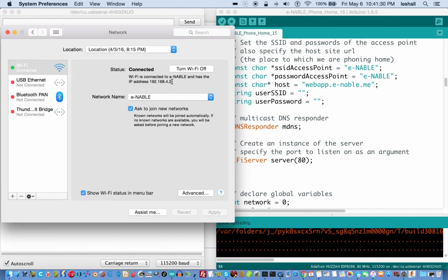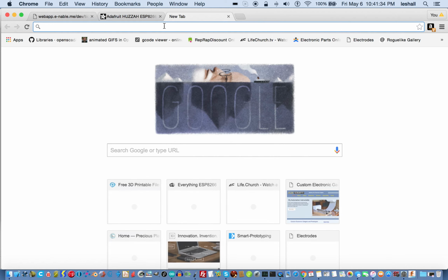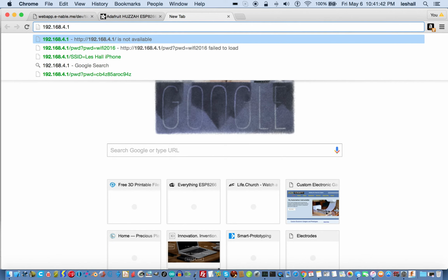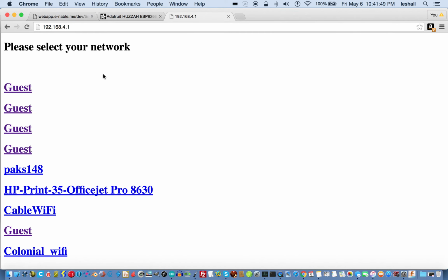So anyway, with that number in mind, we open up our web browser, we type 192.168.4.1, and we previously had this, so let's hit enter, and hopefully this time, there we go. We get a web page.